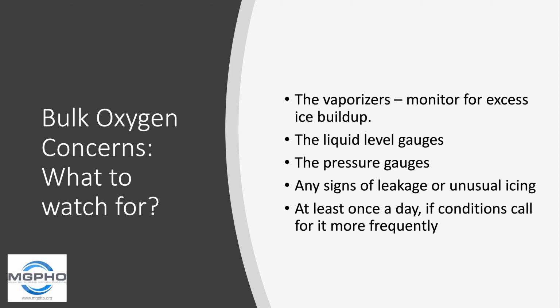As far as how often to do these, we are recommending daily right now, at least once a day. However, if your facility finds itself in a situation that calls for doing this more frequently, you may have to go to twice a day or possibly even three times a day, every 8 hours. So far, for the majority of facilities, once a day has been fine, but for facilities that are experiencing an extremely high ventilator load and other demands on the oxygen system as a result of COVID-19 patients, you may end up having to increase your frequency of rounding. Just keep that in mind.